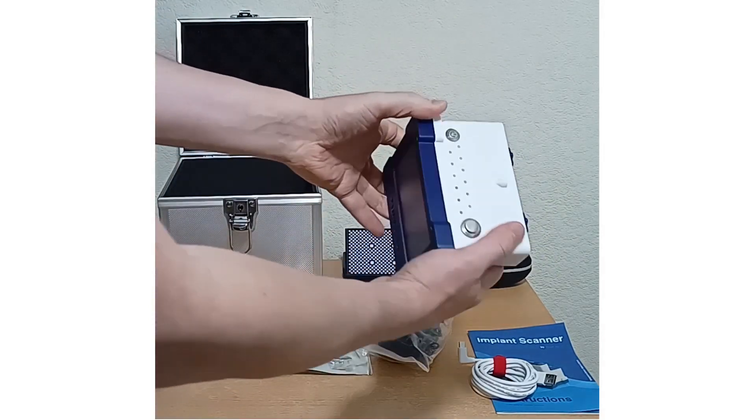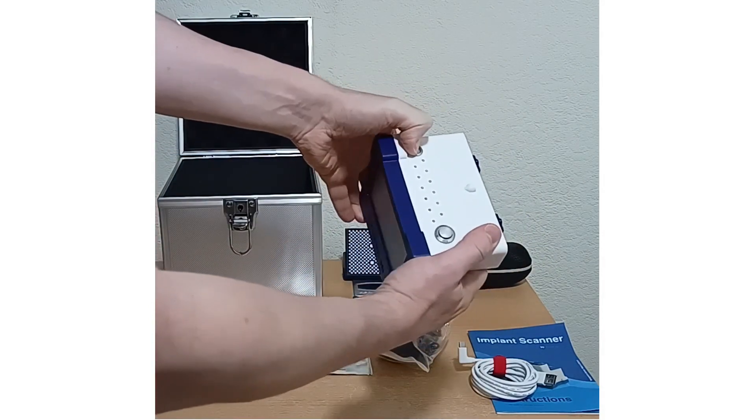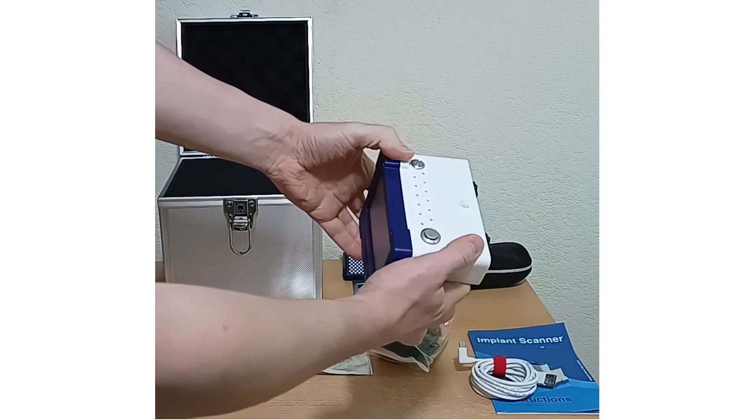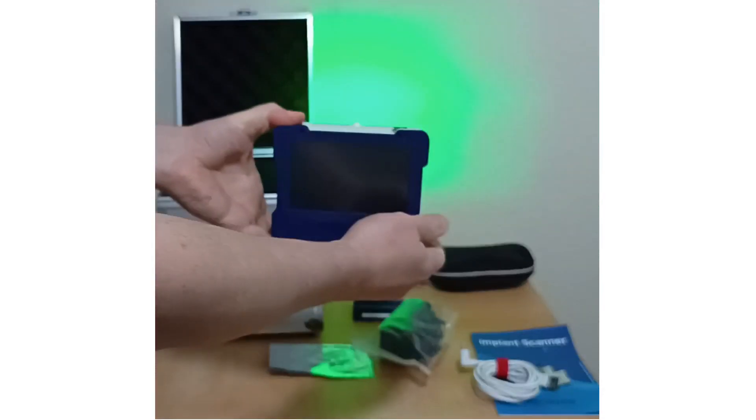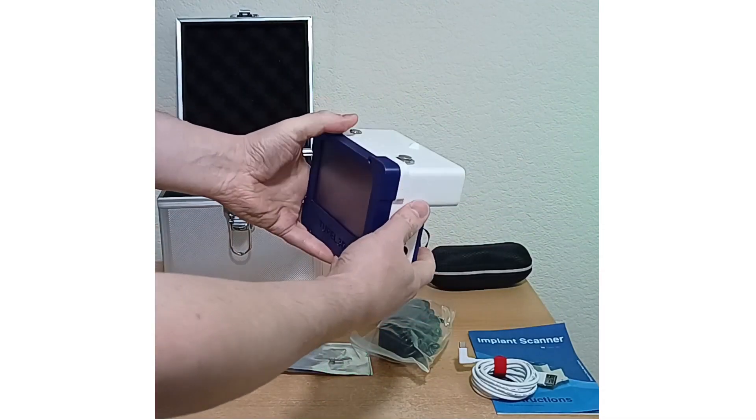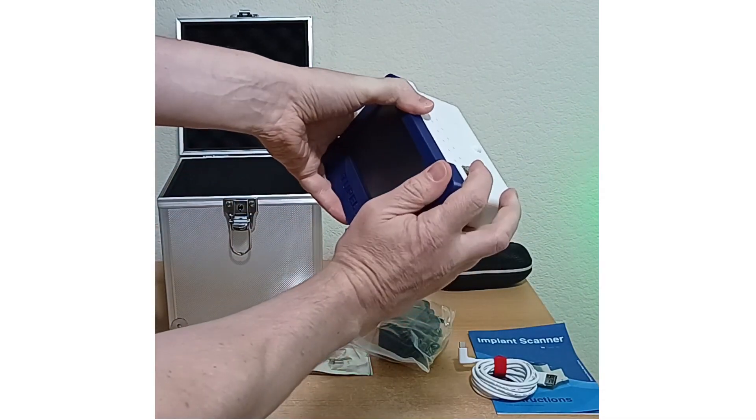We can switch the scanner on here, then you've got the capture button, like on a normal camera.